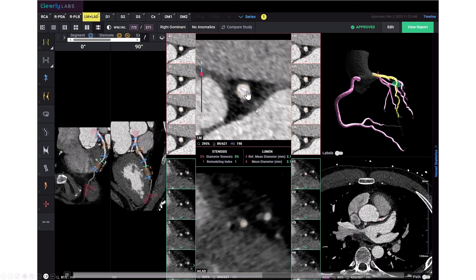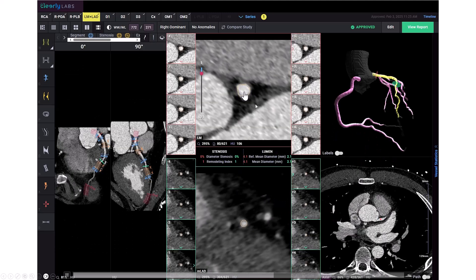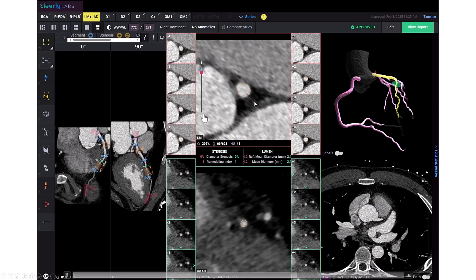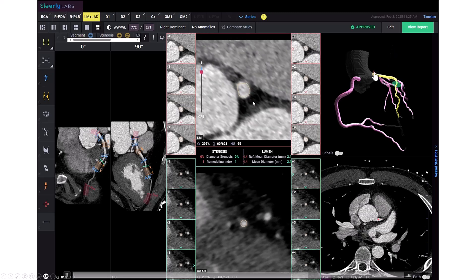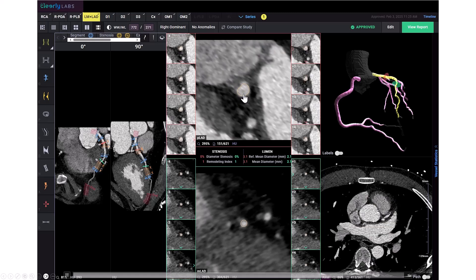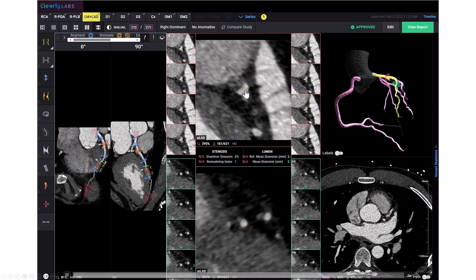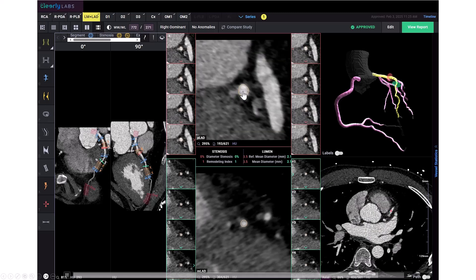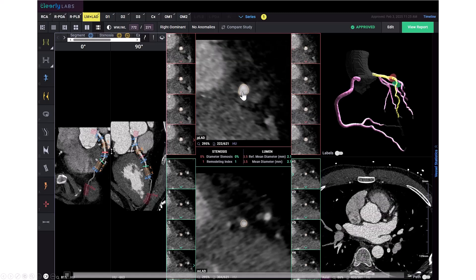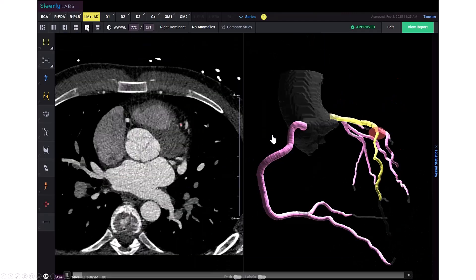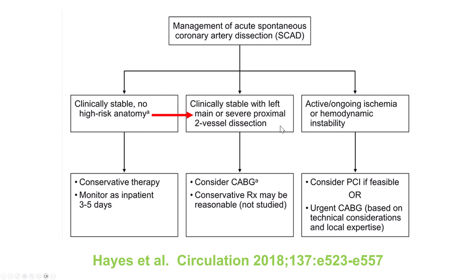These are the cross-sections. We can see that when we are in the left main there is no significant disease, but as we move into the LAD, there is a reduction of the lumen and the filling defect, which is the area of the dissection.